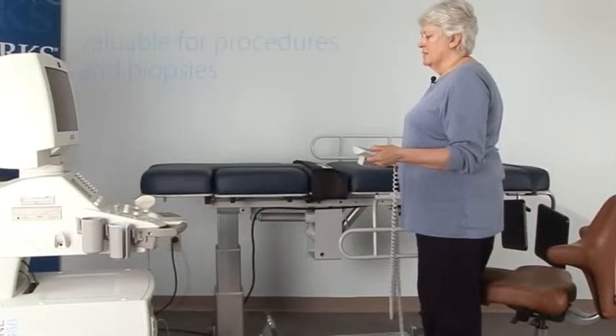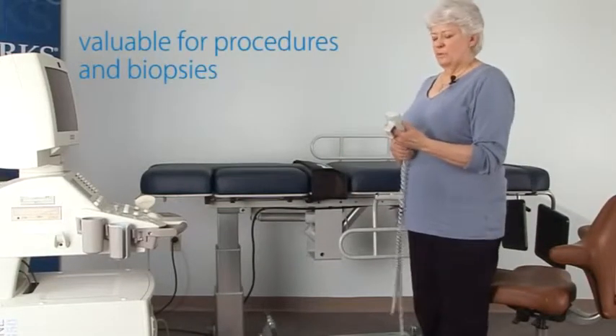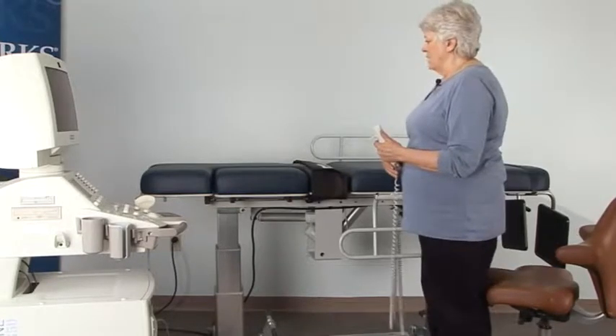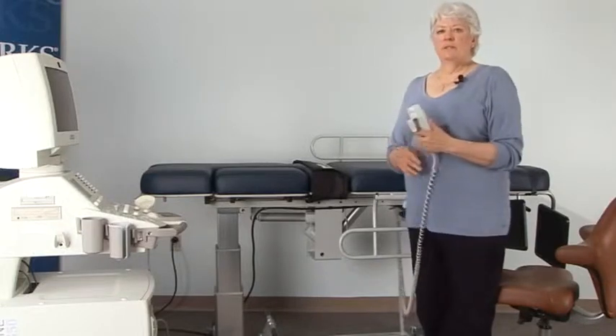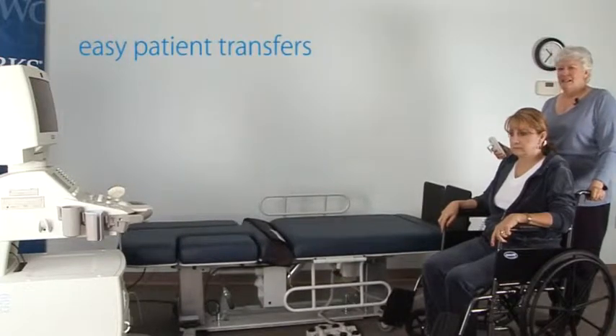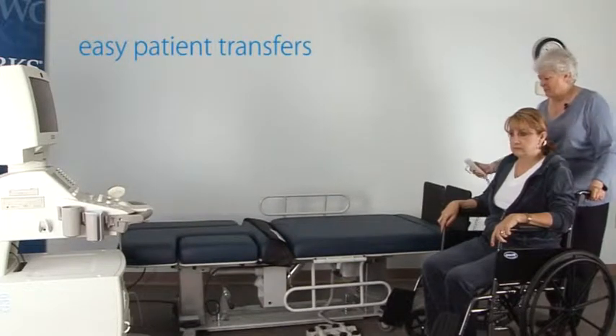This height is also valuable for doing procedures and biopsies because often the physician will want to have it high enough to be able to reach the patient. With the low end of the height range at 22 inches, it allows for easy access for patients transferring from wheelchairs.